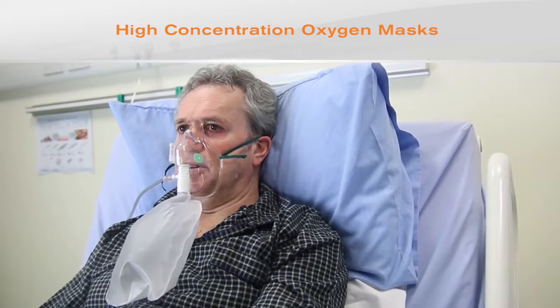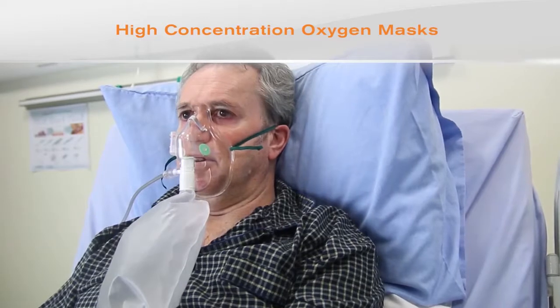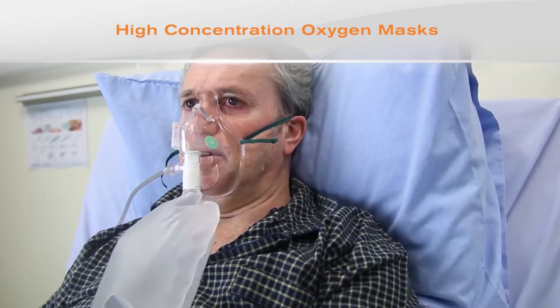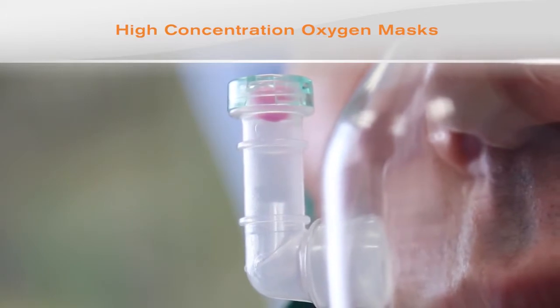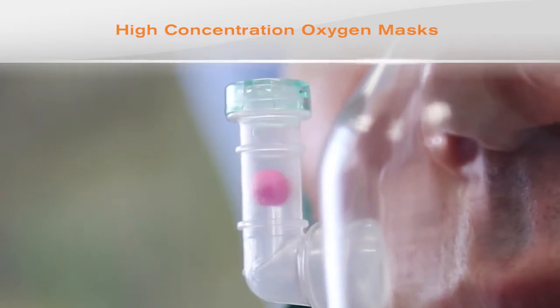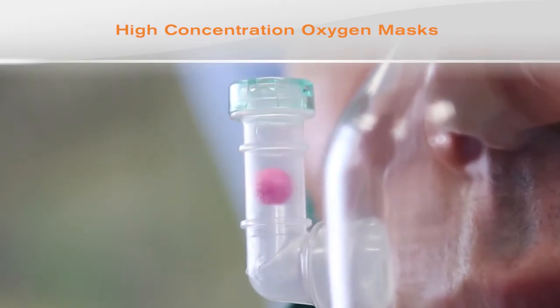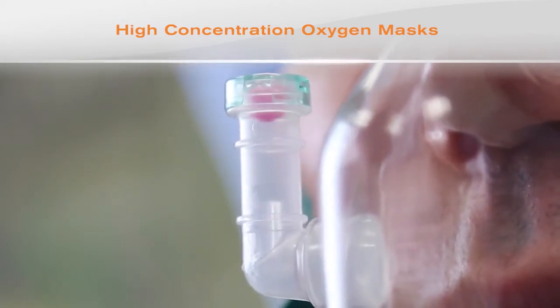An additional feature found in some high-concentration oxygen masks is the RespiCheck breathing indicator. Respiratory rate should be recorded in anyone requiring oxygen therapy, and yet it is often inaccurately estimated and poorly recorded. The RespiCheck features a ball contained in a clear plastic tube which acts as a visual indicator of respiratory rate. The flow of oxygen into the mask pushes the ball to the top of the tube. The negative pressure generated by the patient's inspiratory effort pulls the ball to the bottom of the tube, giving an instant visual notification of each breath taken.